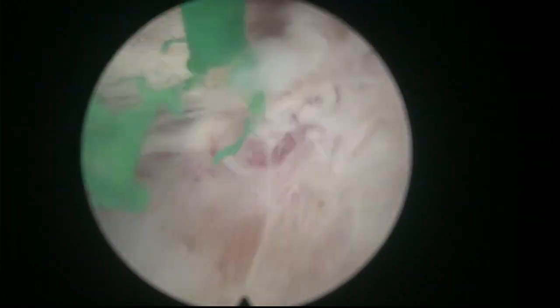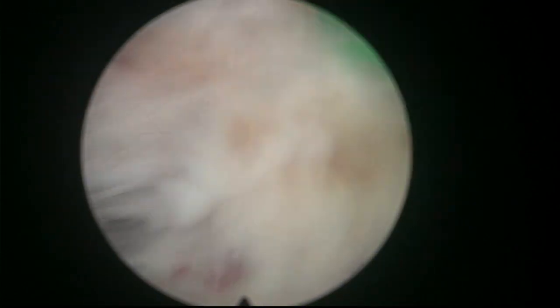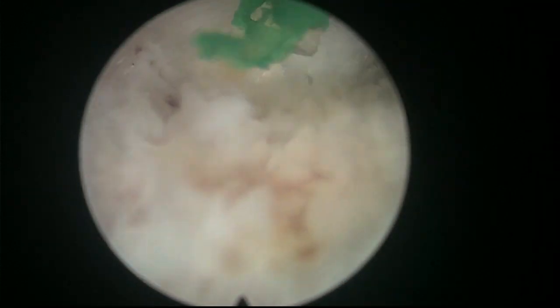And also remember to keep the fiber very close to the adenoma, not to the capsule. We don't want to fire here. We want to fire up there. We release the adenoma progressively without damaging the capsule to a point where we can do a retrotrigonal perforation. Here we are.